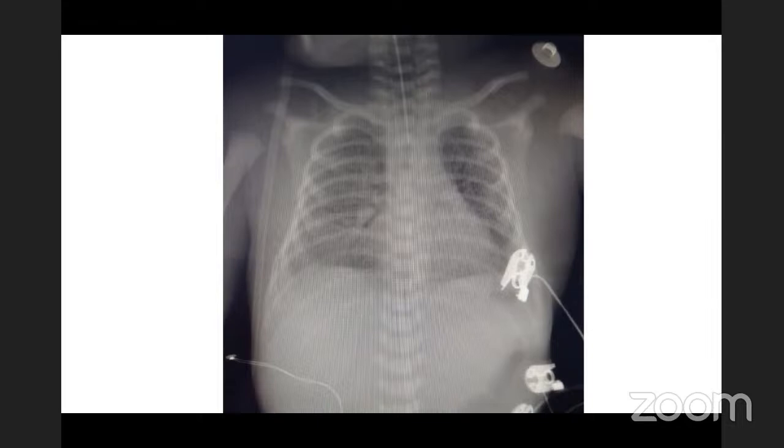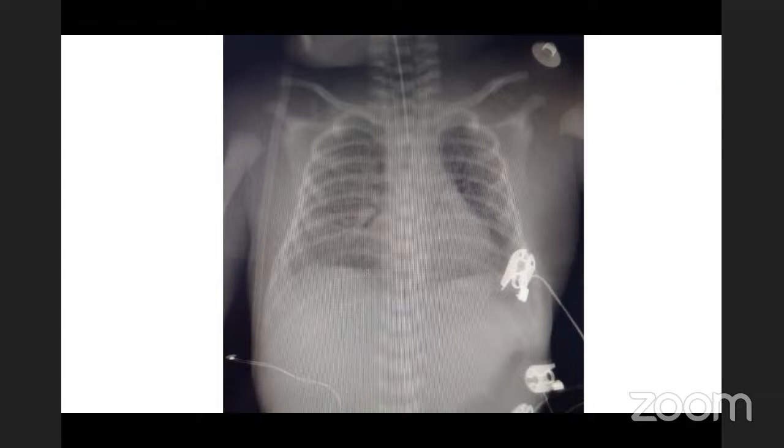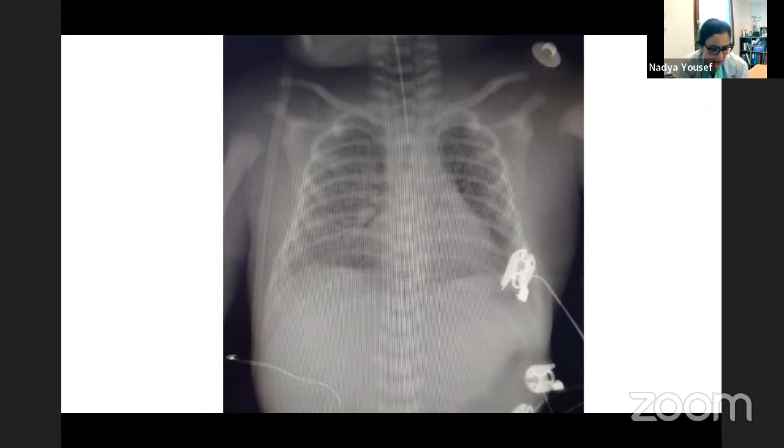Also, Jane tells us that she had chorioamnionitis. And the baby has positive inflammatory markers like CRP above 100 and leukocytes at 22,000. Yeah, it makes sense, really. It makes sense to have these kinds of pictures when you have, I guess, infectious alveolitis, and nobody has really described that. We've described, you know, the more classic pictures with larger consolidations.